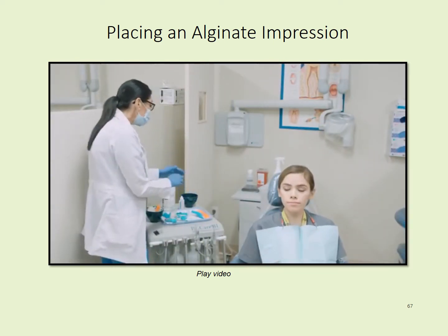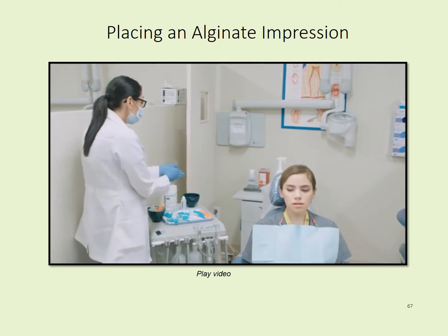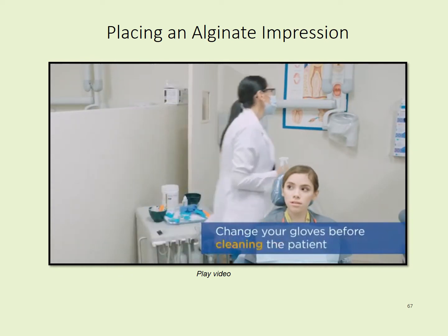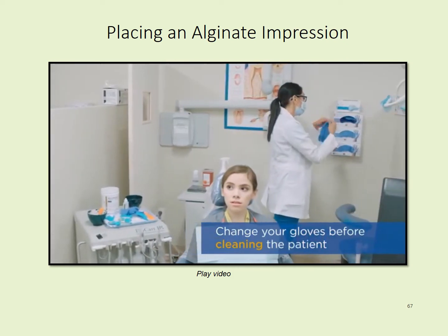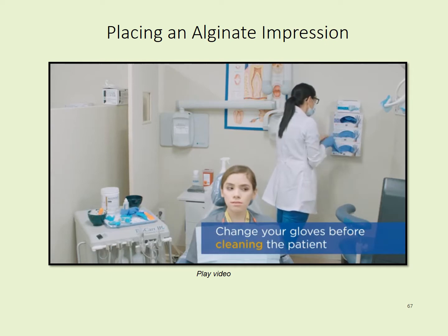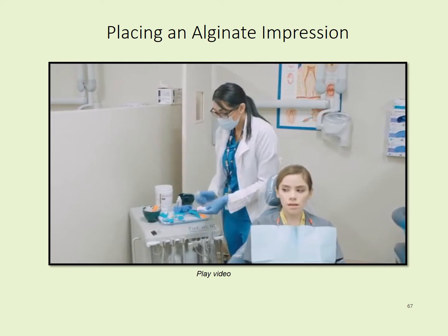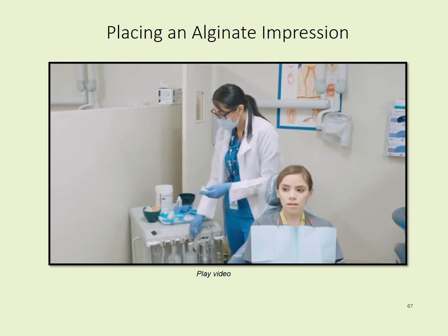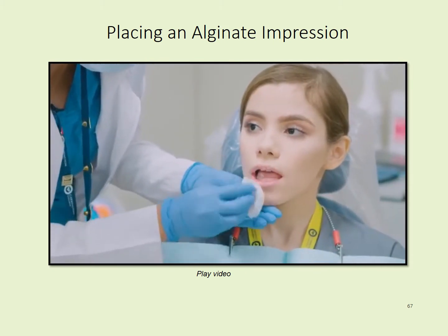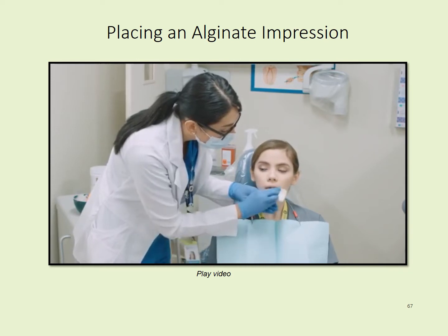After impressions are done, patients usually get really messy from the alginate. And so what you would do, and recommended, is to go ahead and change your gloves and grab a fresh pair of gloves. And on our tray, we have a piece of gauze. You can wet the gauze, and you can go ahead and give your patient a courtesy clean. Sometimes you don't have to do this, and you can just escort your patient to the bathroom.